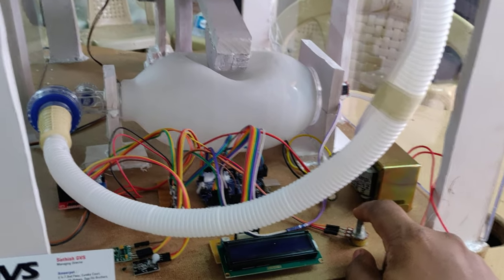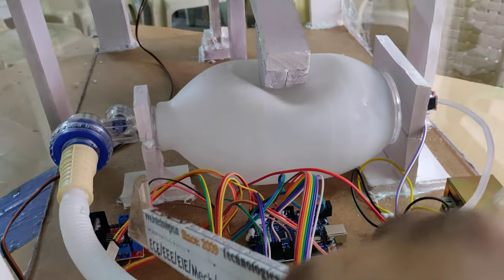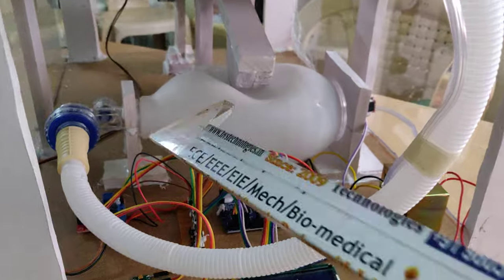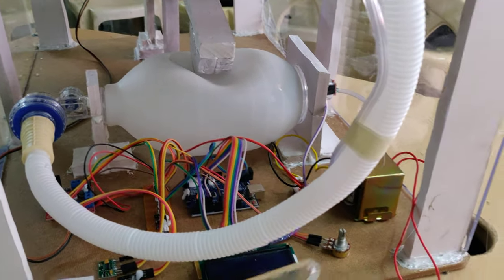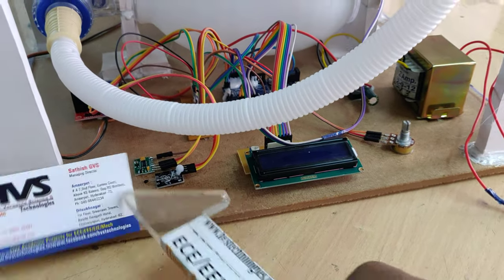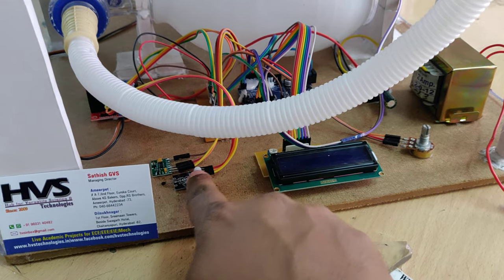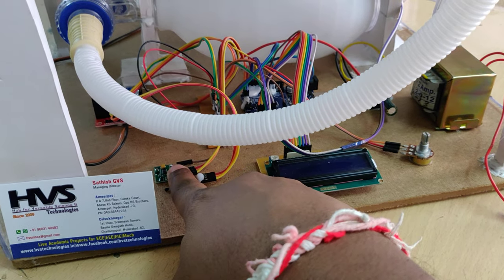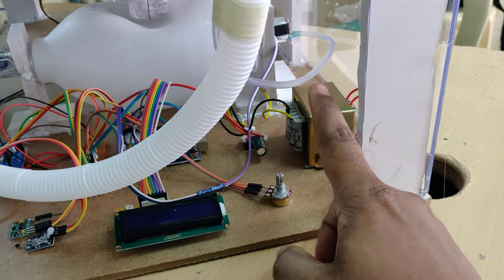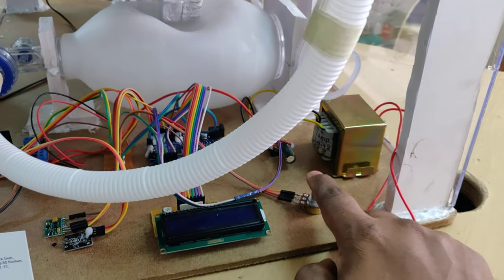When we set this input, the Arduino Uno will control the speed of this DC motor with the help of this L298 motor driver. All the direction is already set, and only the speed is controlled through this L298 motor driver. Coming to the interfacing connections, we have interfaced the MAX30100 as well as the temperature sensor: A0 for the temperature sensor, A4 and A5 for the MAX30100, A2 and A3 for the pressure sensor, and A1 for the speed set potentiometer.